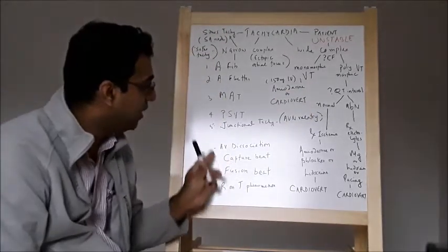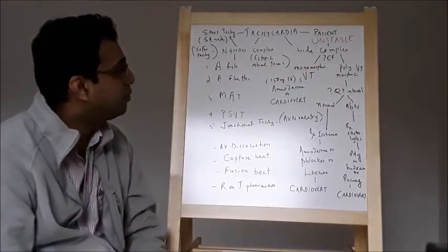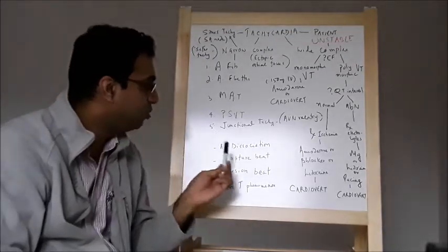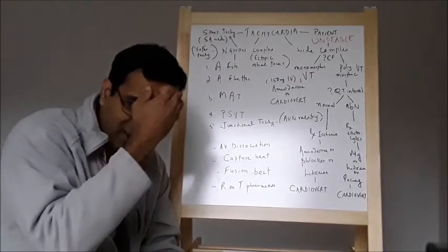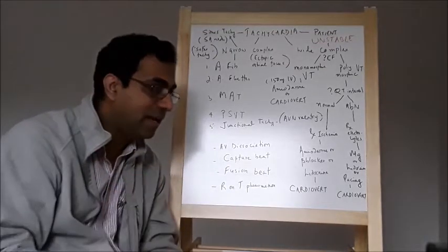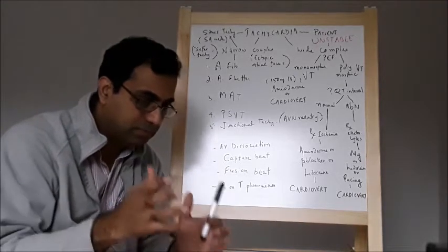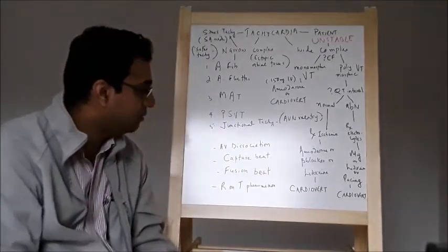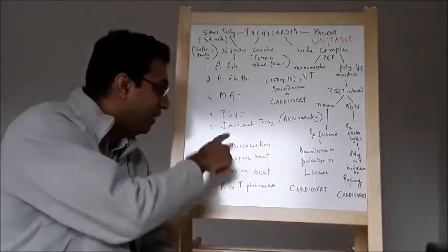So the use of these three is to differentiate ventricular tachycardia from supraventricular tachycardia. I would have to direct you to other EKG strips to see what a capture beat or a fusion beat is supposed to look like. Sometimes it's a little hard to differentiate these beats in the midst of all the clinical activity and the acuity of the clinical situation. But when you have some time after the patient has stabilized, you can take a look at the strip and sometimes you can find these.